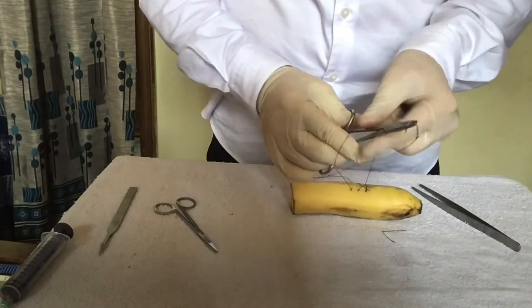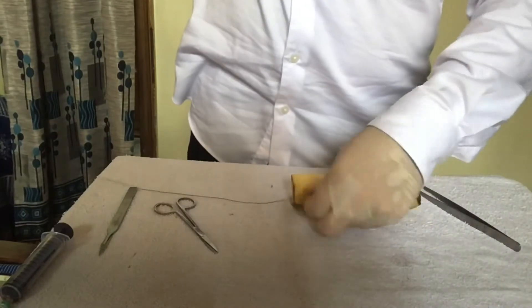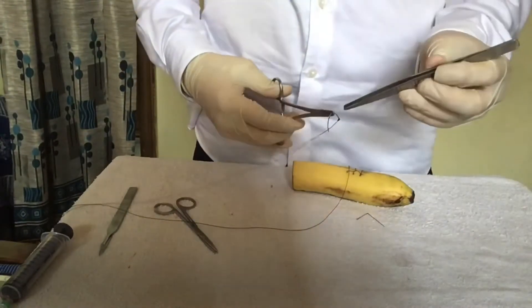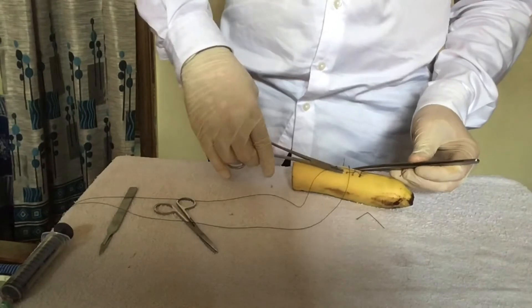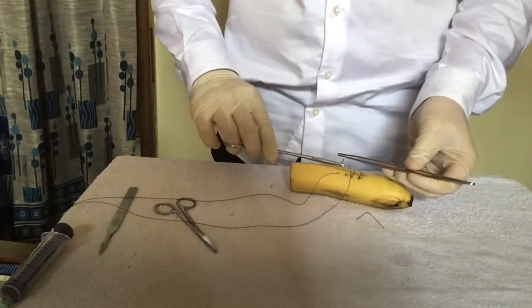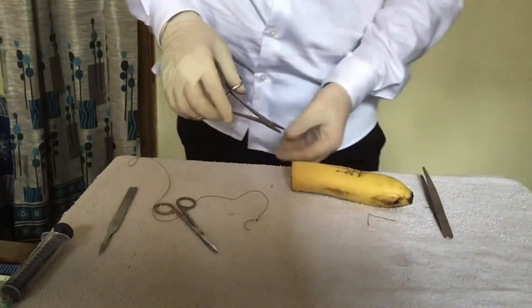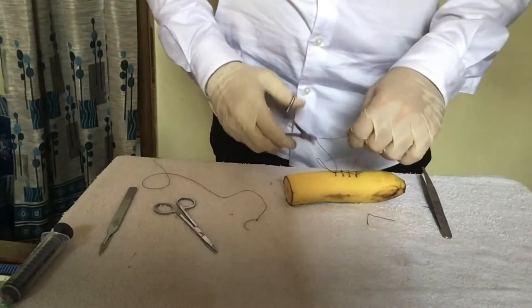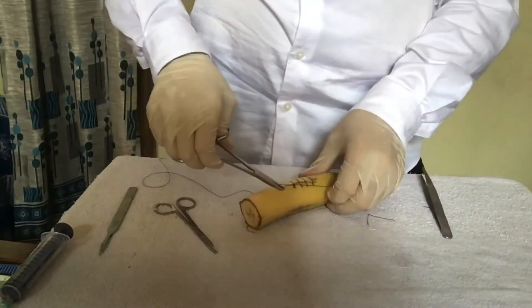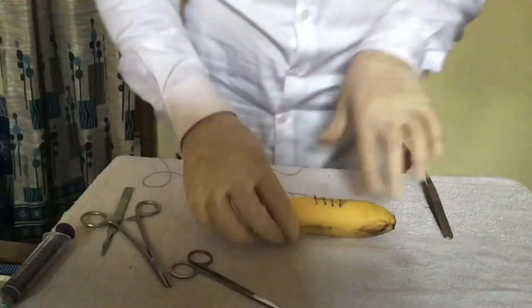Similarly, as done before, pass the needle through the loop again and make your fourth suture. When you anticipate the last suture, ask your assistant to leave the loop and just tie the knot, imagining the loop as your short end of suture. Do it multiple times as shown. At the end, cut the extra threads — the continuous interlocking suture is done.